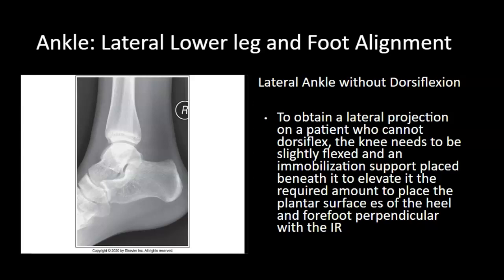To obtain that lateral projection on a patient who can't dorsiflex, the knee can be slightly flexed and immobilized at a point of elevation so that the plantar surface of the heel is perpendicular with the IR. That lateral foot surface, you can bring parallel with the IR in that position.